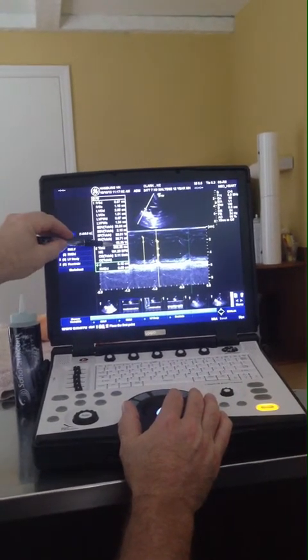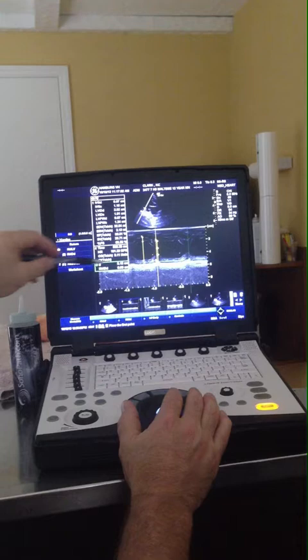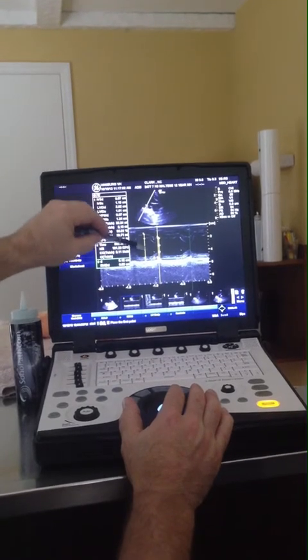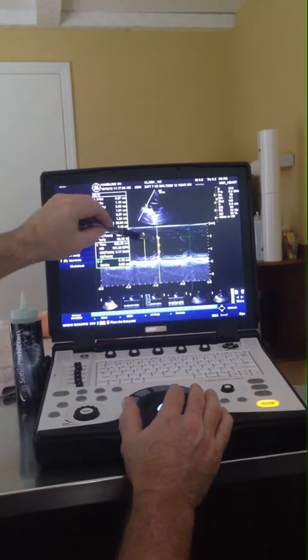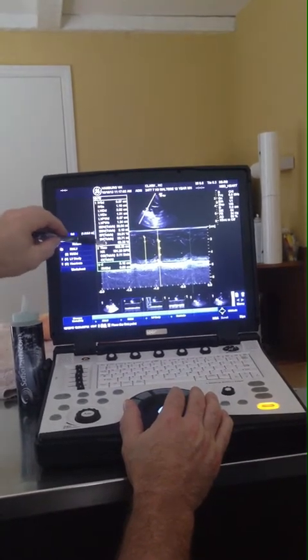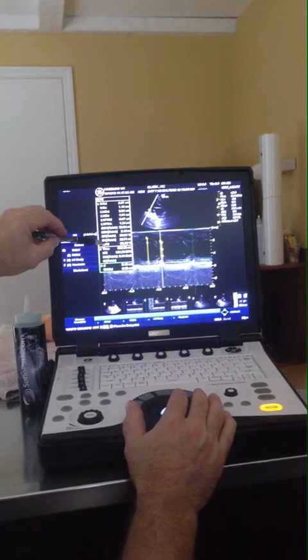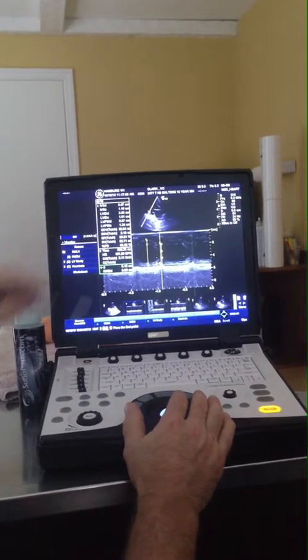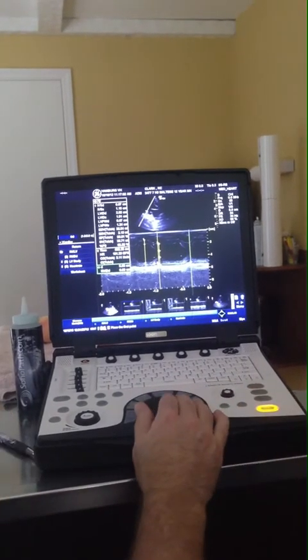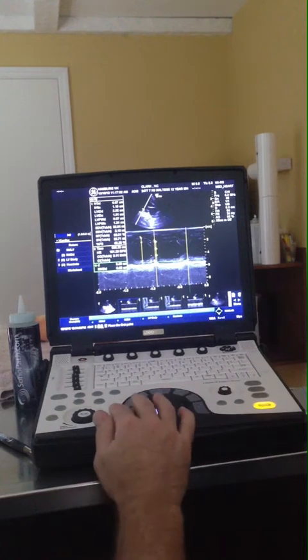Fractional shortening is 65%, which makes sense because there's a lot of difference between diastole and systole, so we should expect a fractional shortening that's really high. I'll save that one. So that's LV M-mode. Now we're going to look at the next measurement.